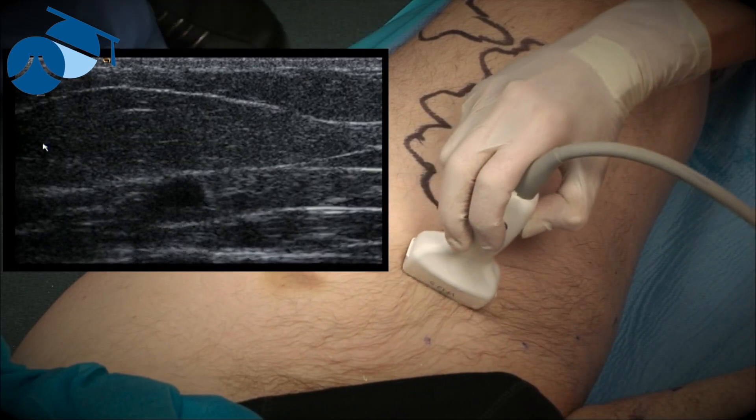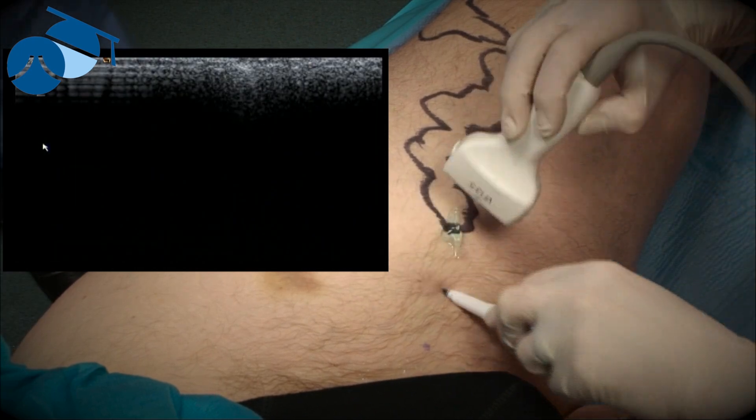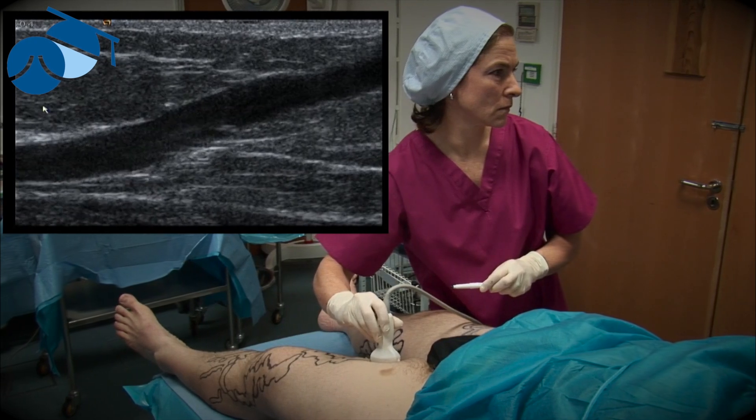These are the areas that we treat with endovenous surgery. Once the vein comes through the fascia to the surface, we wouldn't want to use endovenous thermoablation as we might burn the skin.